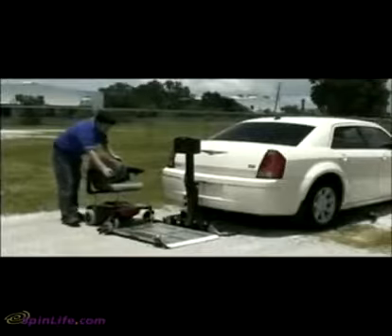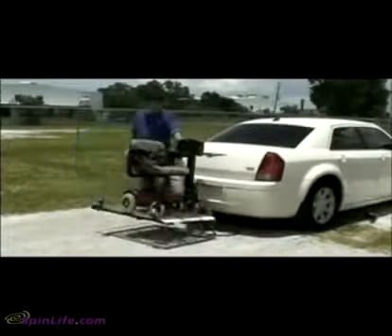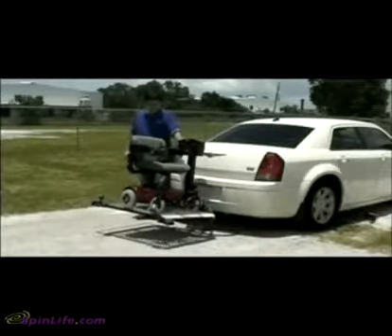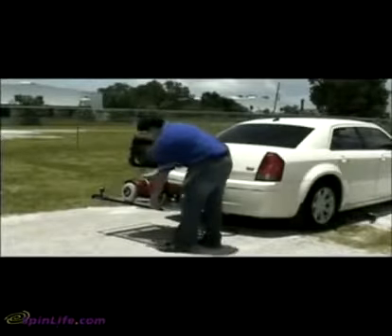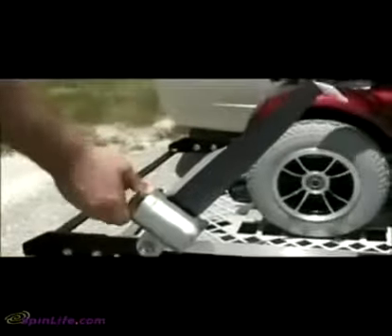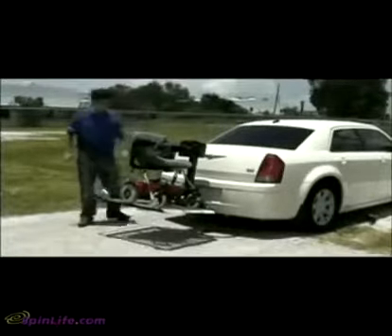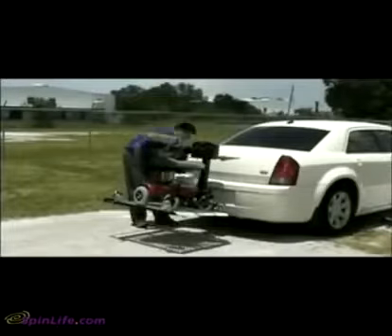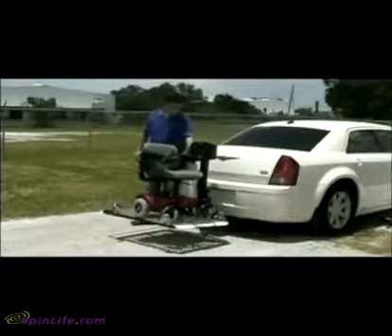To transport a power chair, drive the chair onto the center of the platform and raise the lift. Once the lift is in its fully raised position, connect the four automatic retractors securely to the anchor plate. Once you have ensured a secure fit, the chair is ready for transport. To remove the chair, remove the four retractors, power the lift down, and drive the chair off of the lift.